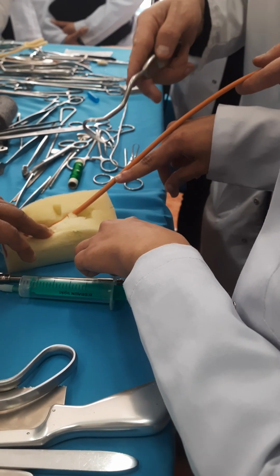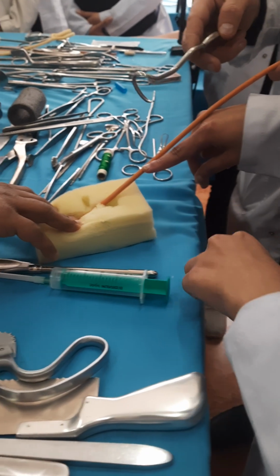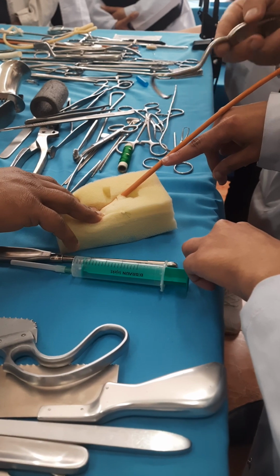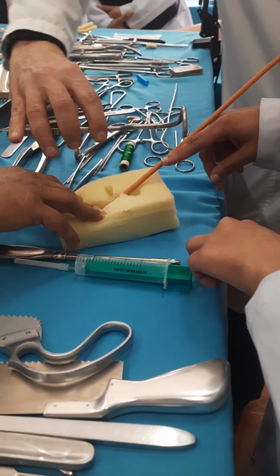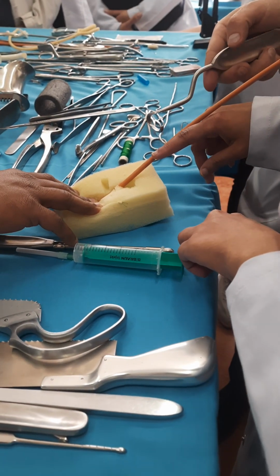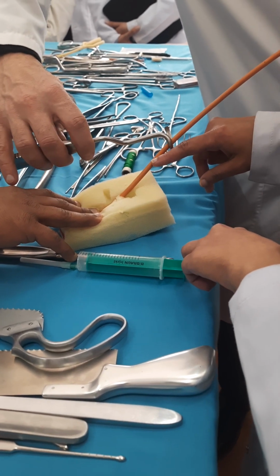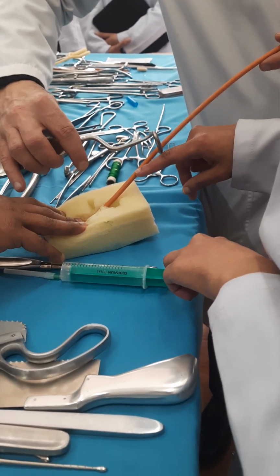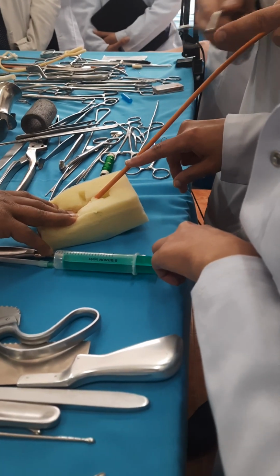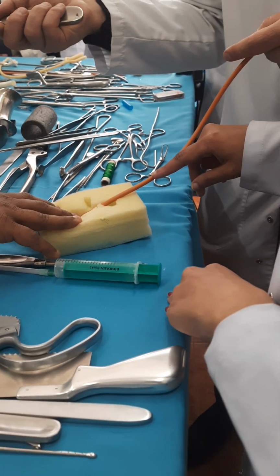Brilliant. Now imagine that this is, for example, vein, this is artery. You know that the artery is damaged. You now must provide it the instrument. Don't do it in this stupid way. The tip will touch the vein and damage it. From non-damaged vessel to the damaged vessel, not vice versa. Only provide in such a way, from non-damage to damage, not from damage to non-damage. Because the tip will attach to the non-damaged vessel, the intact vessel, and can perforate it simply.